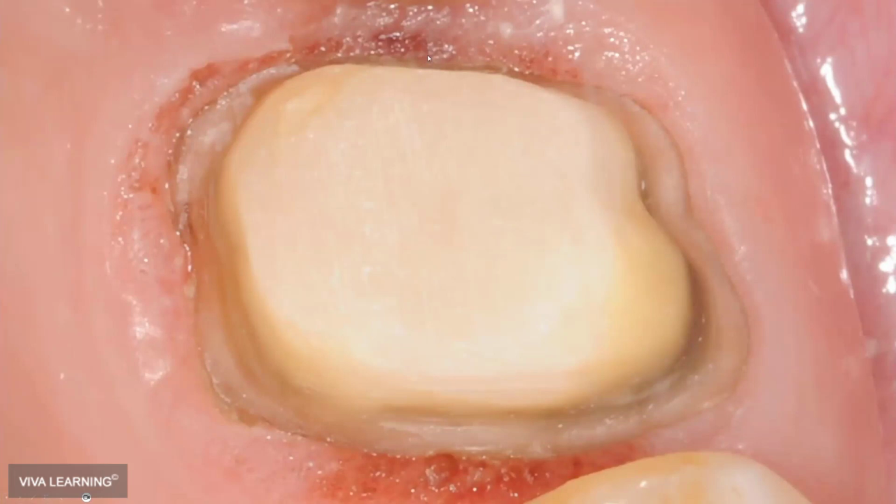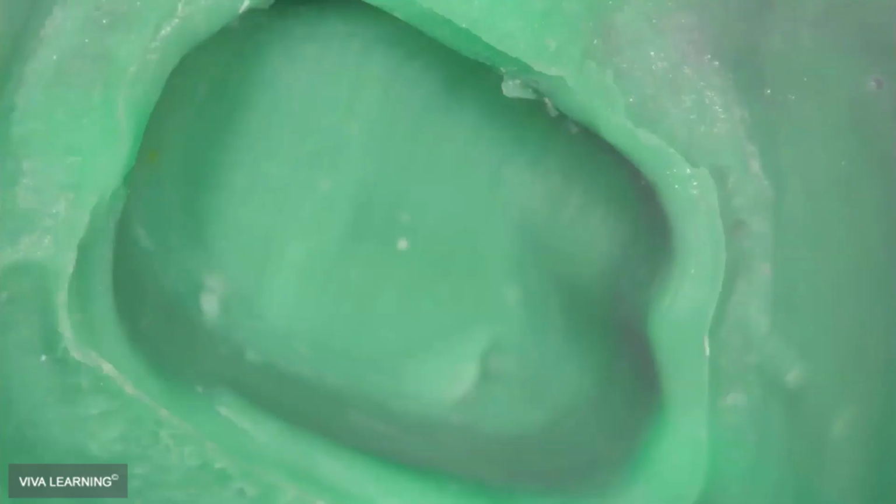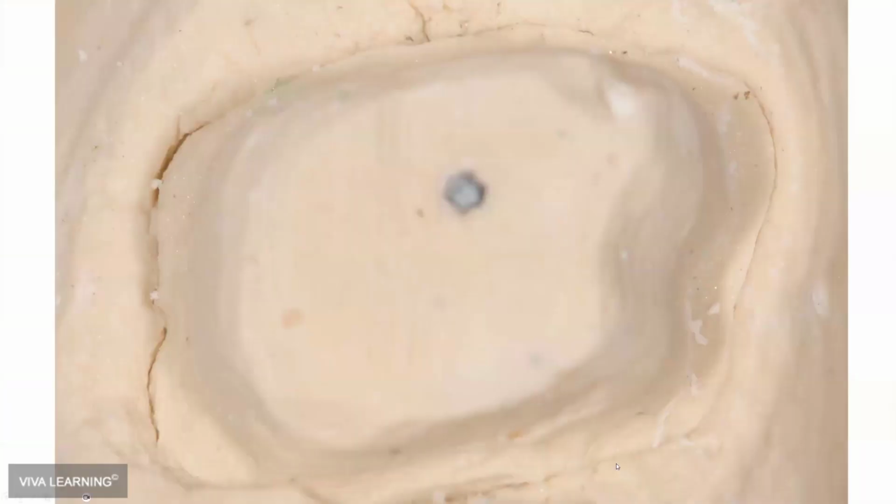You can dry the sulcus really well, because keep in mind you have vasoconstriction for 5-7 minutes. So there will be no additional blood coming into the gingiva and no additional fluids. Then you have all the time in the world to take the intraoral scan. In this case, actually, we used regular impression material, so an analog technique. And you can see here on the model, every dental technician in this world can see the margin of the preparation. This will be an easy job for anyone.